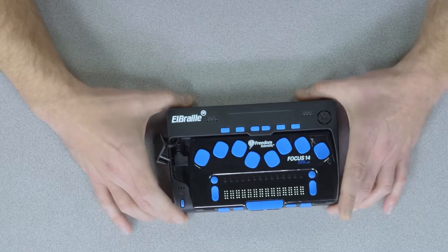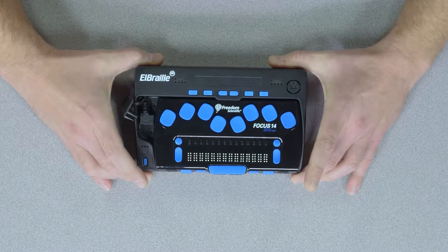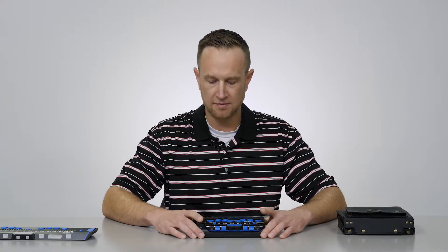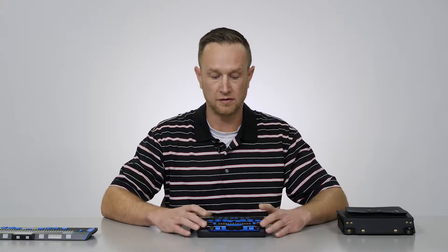The LBraille 14 is a really cool new device that combines a few different tools from Freedom Scientific into one larger tool that does a lot of different functions. Essentially, it is the LBraille itself — a Windows 10 based computer that is driven by the Focus 14 Blue Braille display and JAWS software, JAWS home or pro version software.